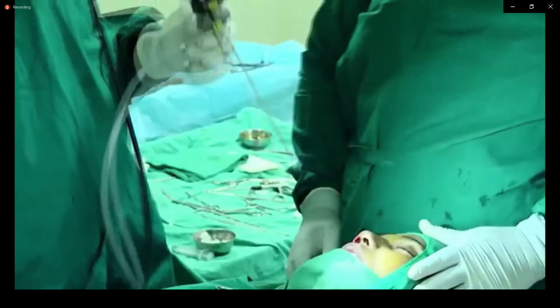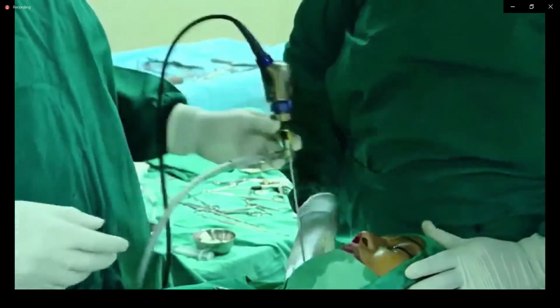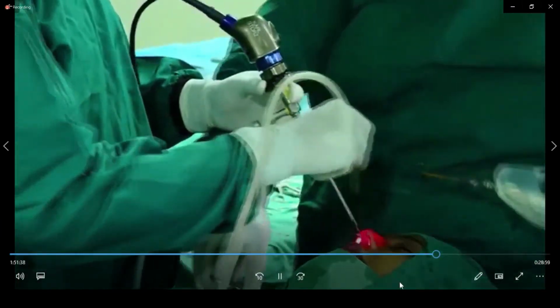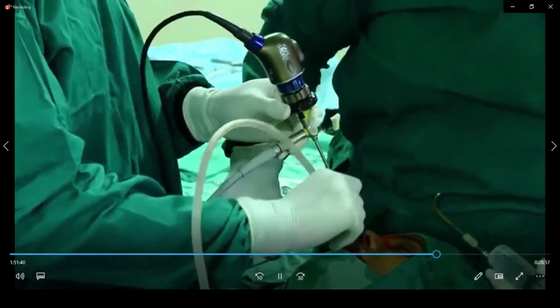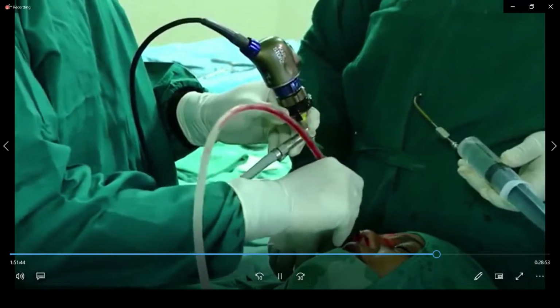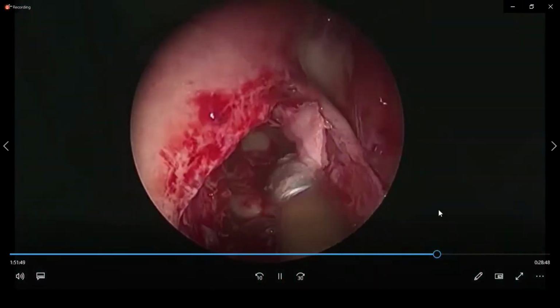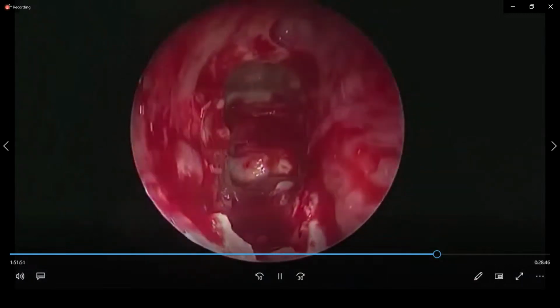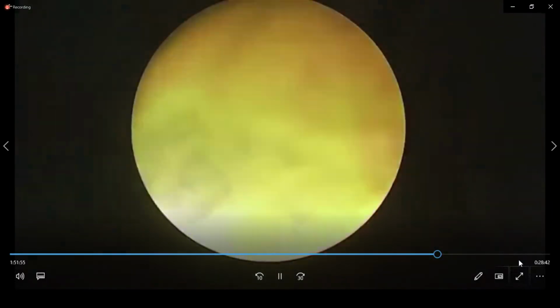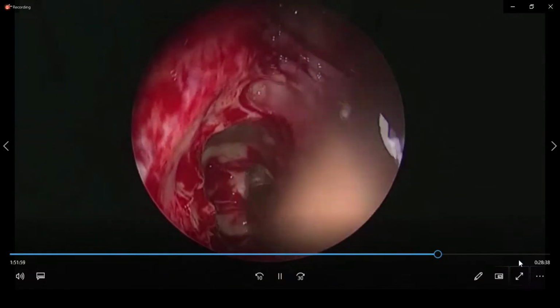The margin of safety to the complications, to skull base injury, to orbital injury, to anterior ethmoidal artery injury, all these are not uncommon if you deviate from your principles, as the margin of safety is very less. And see this, more and more. See now, to begin with, how hidden was the frontal sinus drainage pathway. There were multiple openings.